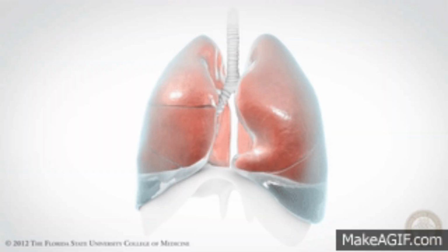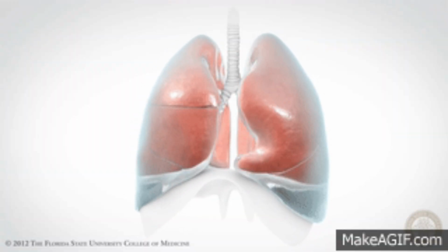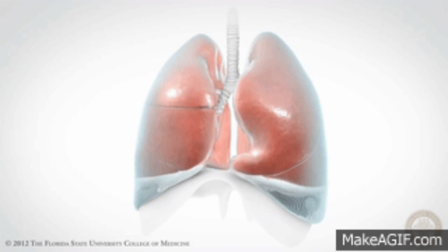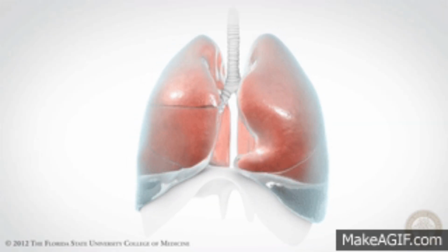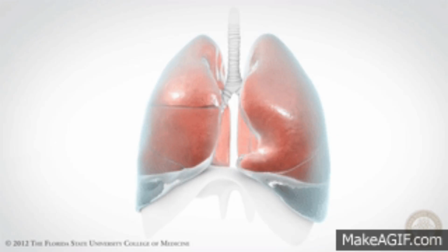A chest tube is a flexible tube inserted into the pleural space to drain air, blood, or fluid. This helps re-expand the lung and restore proper breathing. It's often used for conditions like pneumothorax, hemothorax, pleural effusion, or post-surgical drainage.